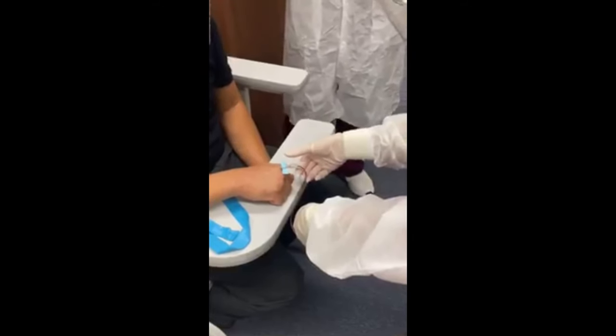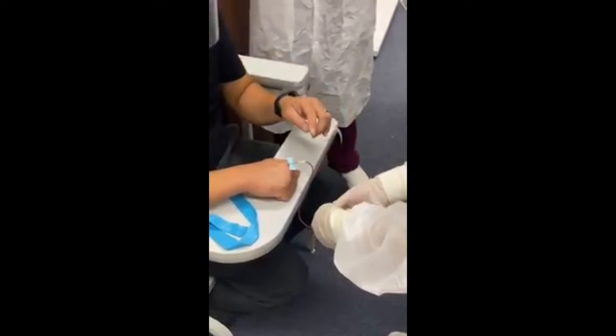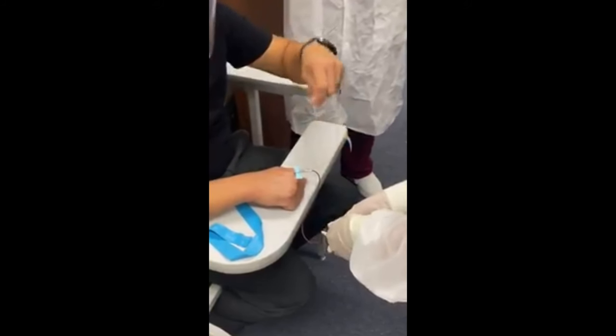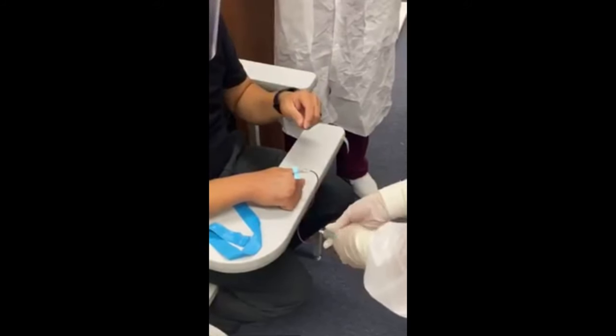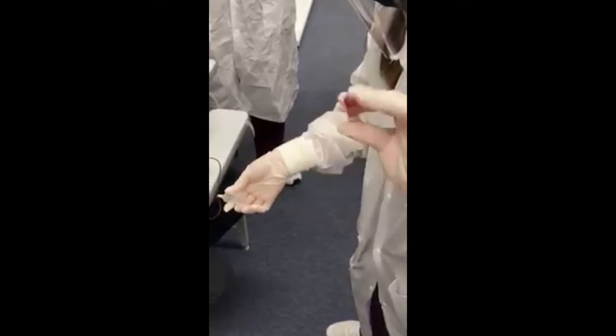No, you're fine. So with this one, since you took out the tourniquet, you can now remove the tube. You can remove it at the same time, twisting going up. Perfect, just like that. Okay, and then invert how many times? Eight. 8 to 10 times, perfect.